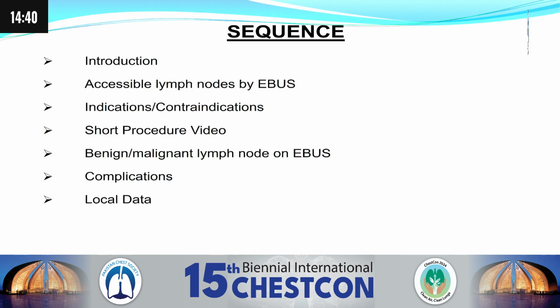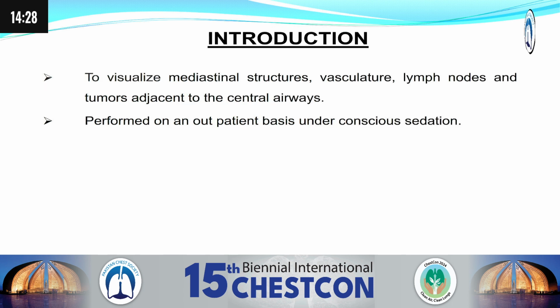This is the sequence of my presentation. I will show one short video of endobronchial ultrasound, which is available in few centers in Pakistan. Endobronchial ultrasound is used to visualize mediastinal structures and lymph nodes or tumor adjacent to the central airways. It is performed as an outpatient procedure and under conscious sedation.